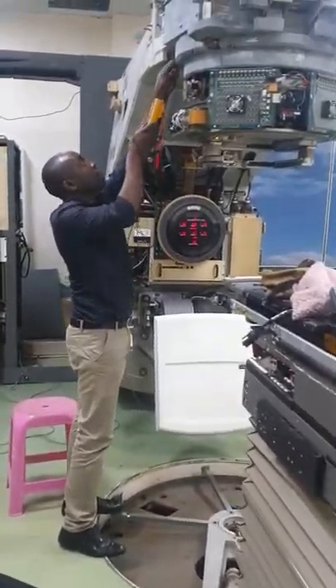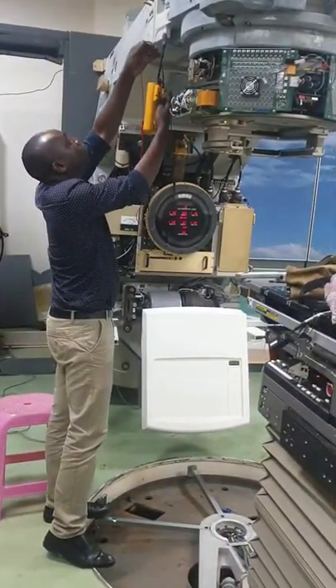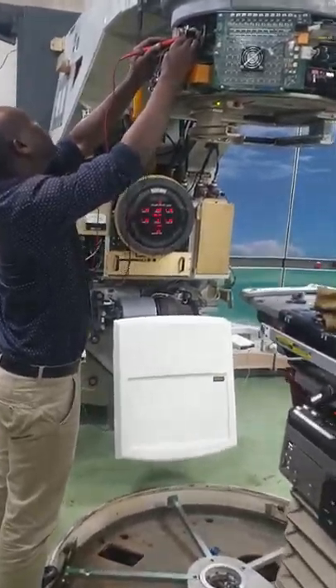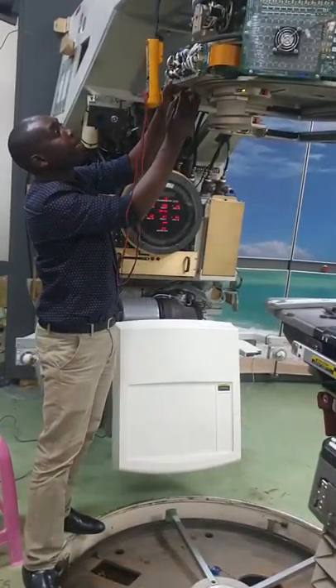He is now working on the MLC. He is checking if we can have a problem with our power supply to the collimator, and also the miniature circuit breakers found on that power supply.